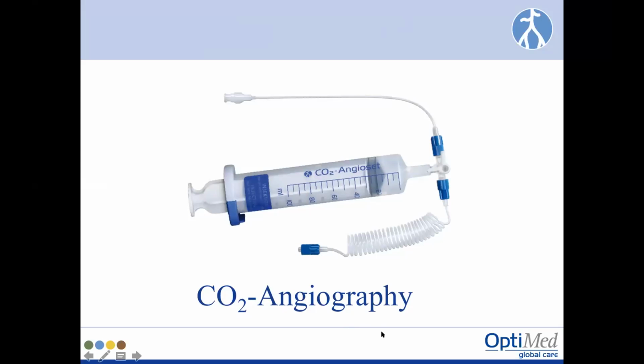Now, this is the syringe I was talking about. You can see it's about 100 ml capacity. The blue thing here is the lock. The end at the top gets connected to your connector, which is connected to the cylinder of carbon dioxide. And this blue end is connected to your catheter, which is already placed inside your blood vessel through your angio sheath.